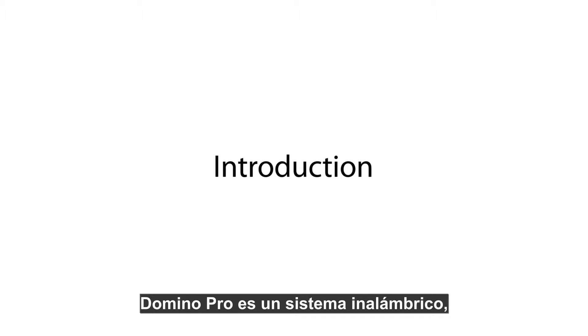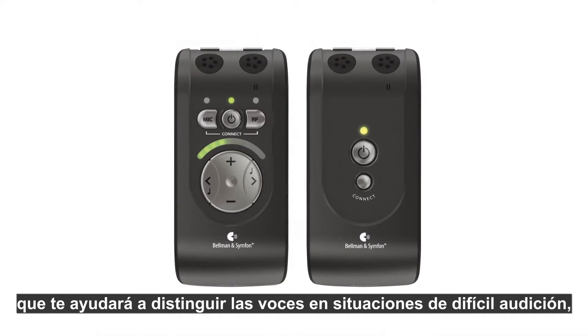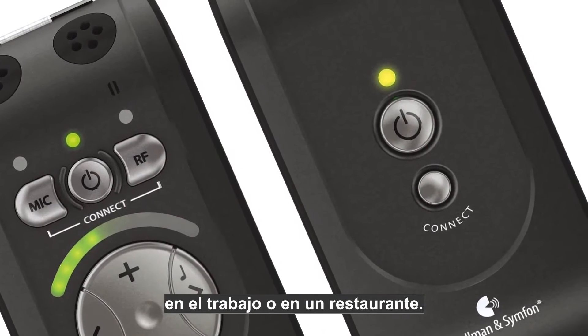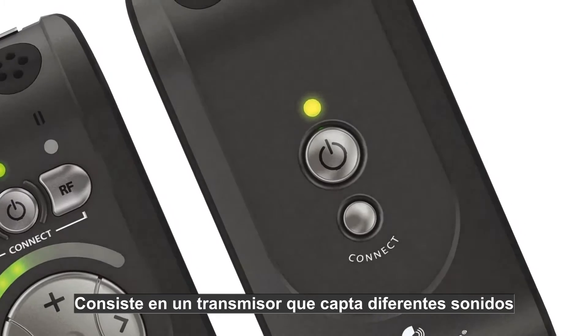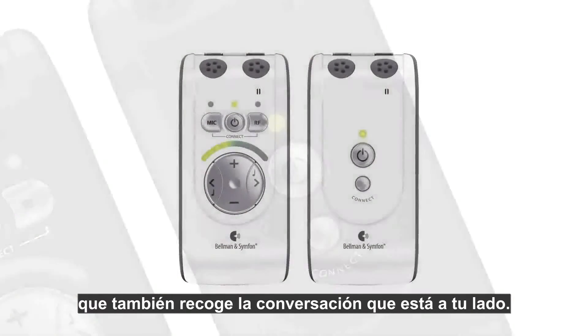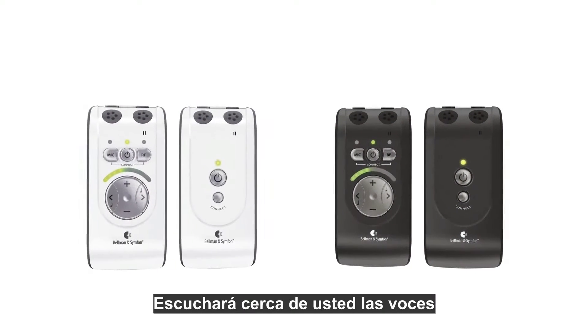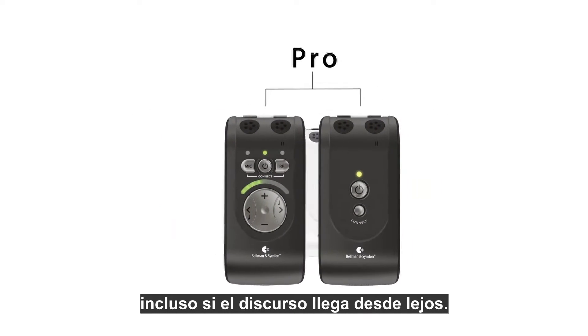Domino Pro is a wireless system that will help you distinguish speech in difficult listening situations such as school, at work, or in restaurants. It consists of a transmitter that picks up distant speech, linked wirelessly to a receiver that also picks up the conversation next to you. Together they deliver the words directly in your ears, even if the speech comes from a distance.